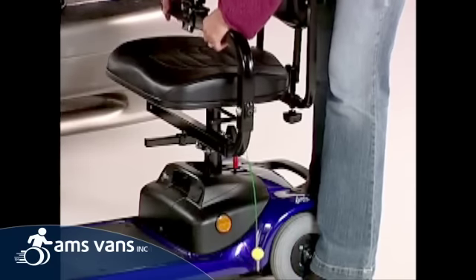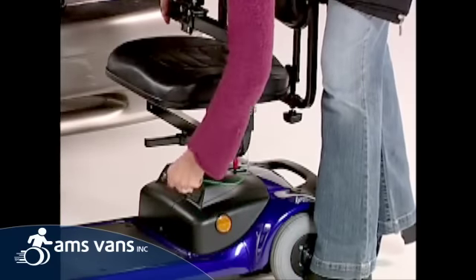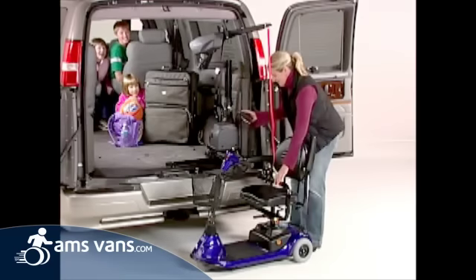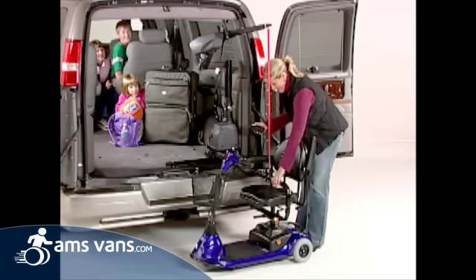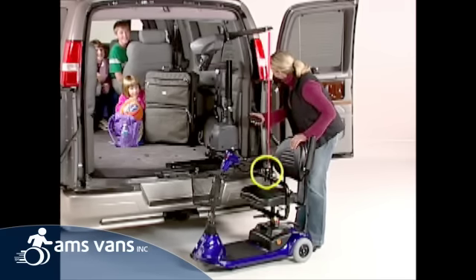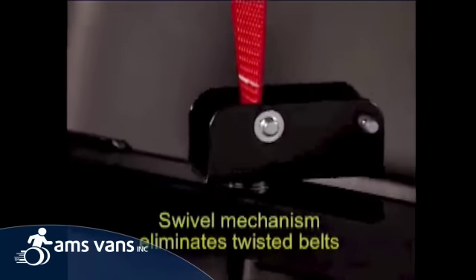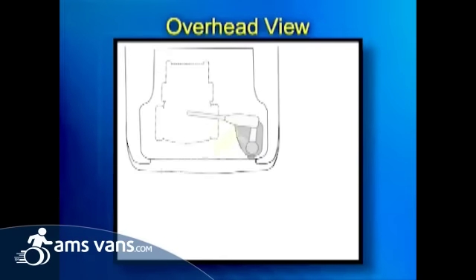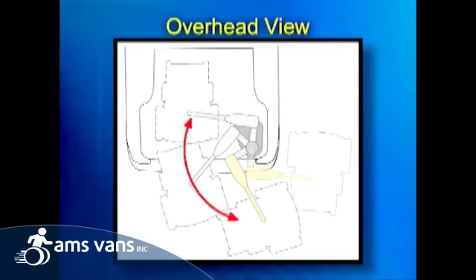To lift a scooter, simply insert the adjustable C-Arm into the receiver tube beneath the scooter seat. Then push the up button on the pendant to raise the fully assembled scooter. You will note that the Curbsider can pick up the scooter from behind the rear bumper, at the corner of the vehicle, or at the curbside.